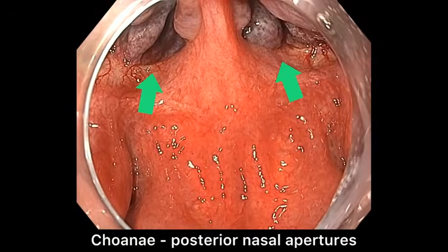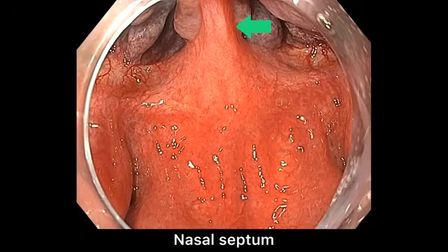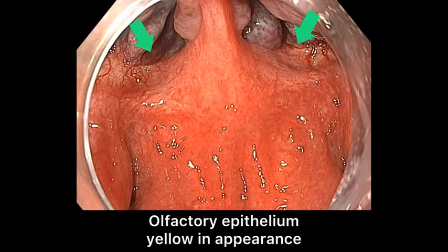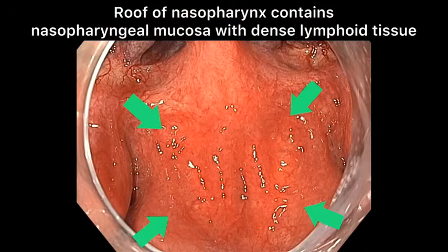Image 1, centered view. Choanae, nasal septum, posterior ends of turbinates, and the olfactory epithelium. The roof of the nasopharynx contains nasopharyngeal mucosa with dense lymphoid tissue.